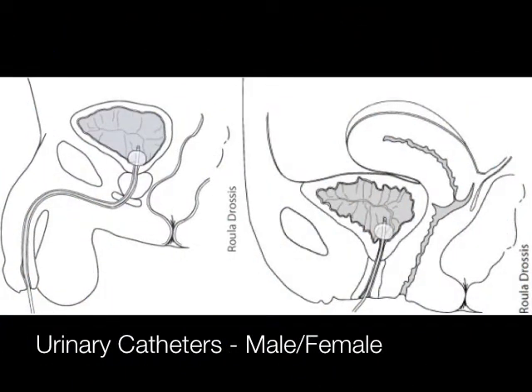Urinary catheterization involves the placement of a tube, or catheter, into the urinary bladder via the urethra. Catheterization is one of the most commonly performed procedures in the hospital setting, and should be a familiar practice to all medical trainees. Urinary catheters have been used as a medical instrument since the times of Hippocrates, and today is considered an essential skill for all physicians to possess.